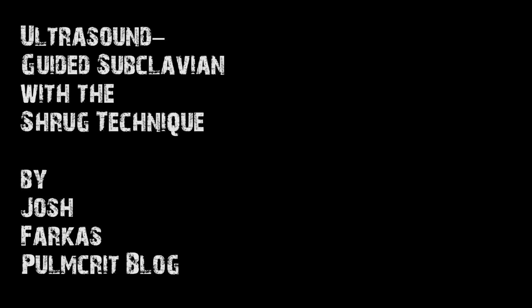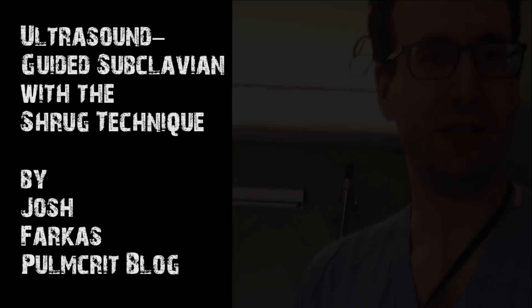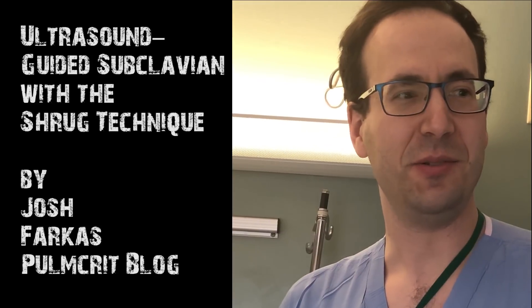Hey, it's Josh Farkas with the PulmCrit Blog, University of Vermont. We're going to do a quick teaching video here on how to do an ultrasound-guided subclavian line. This is Alejandro, one of our residents, who's been conned into doing this procedure.